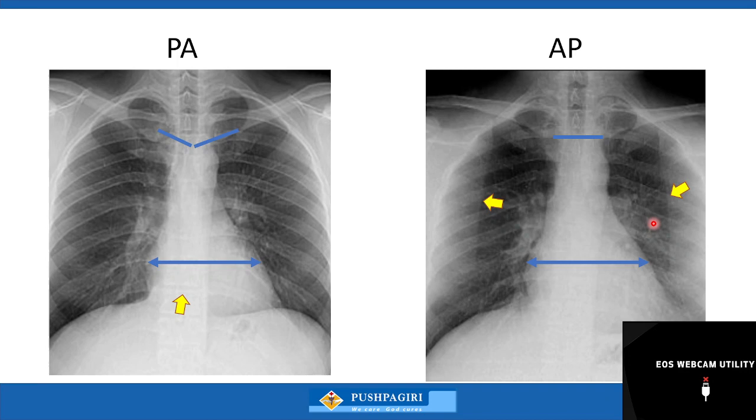This will be more of a horizontal, but either a typical AP or so, actually. For sure, horizontal line.